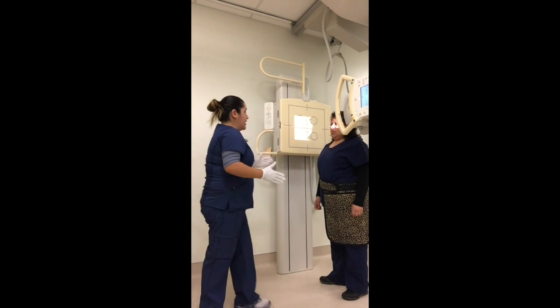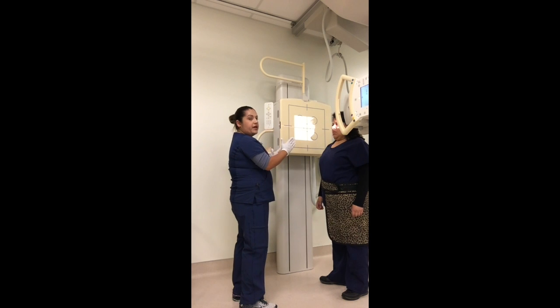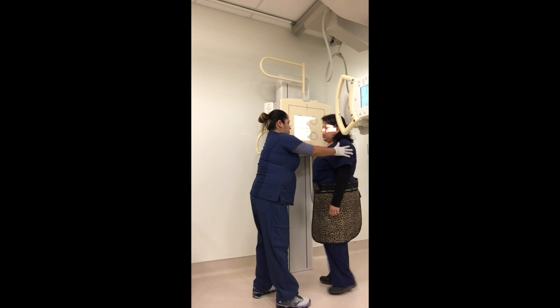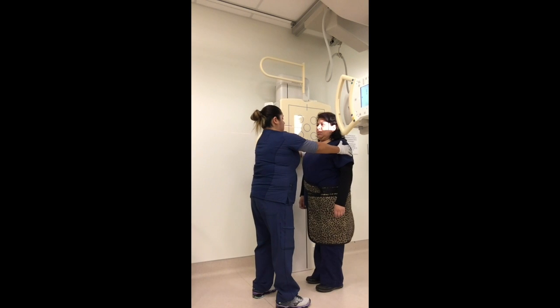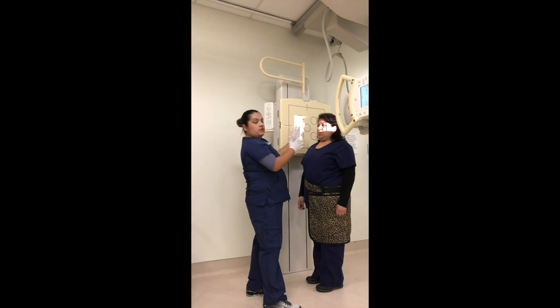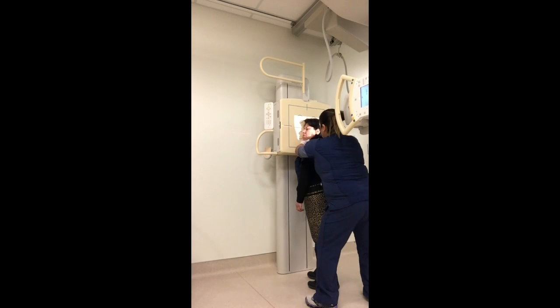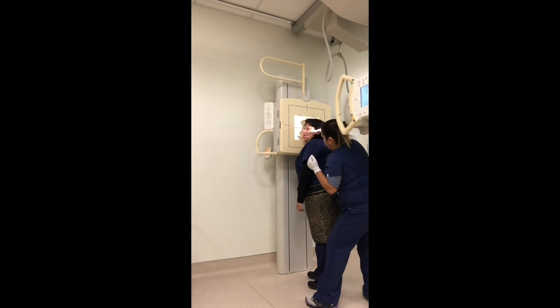I want my patient's mid-sagittal plane parallel to the Bucky. Face me. And then I'm going to slightly oblique her because I want her face against the Bucky. And I want her interpupillary line and her IOML perpendicular to the Bucky.